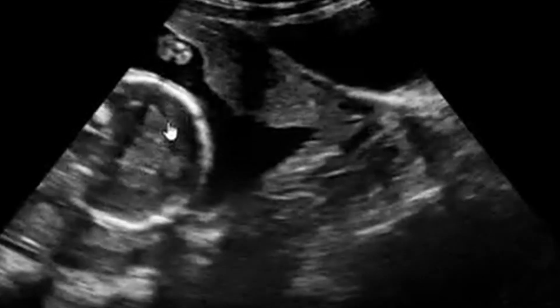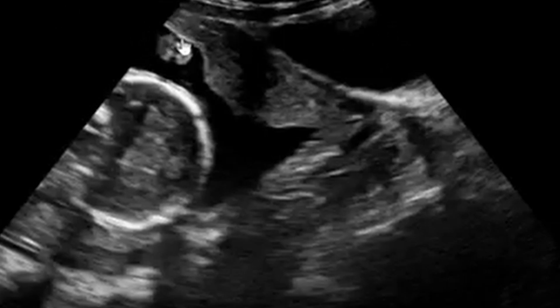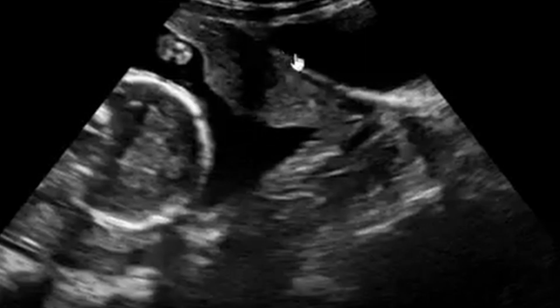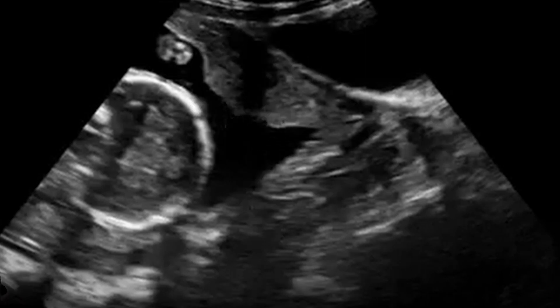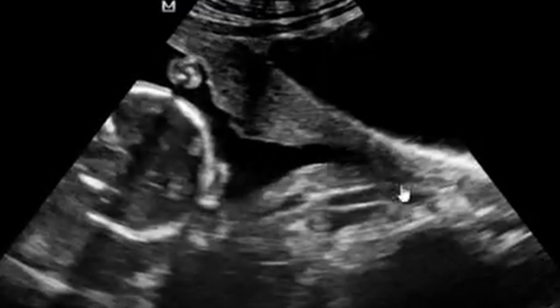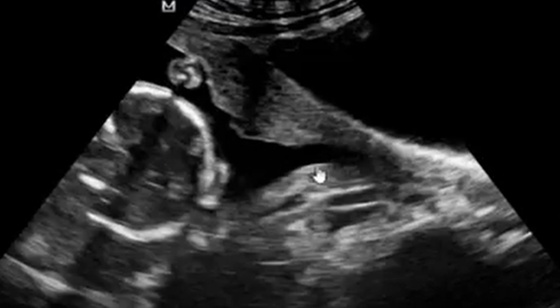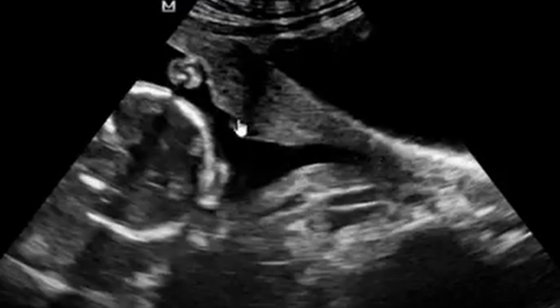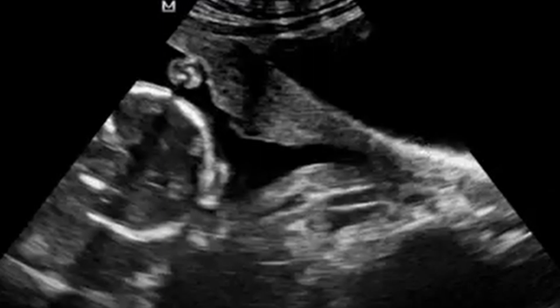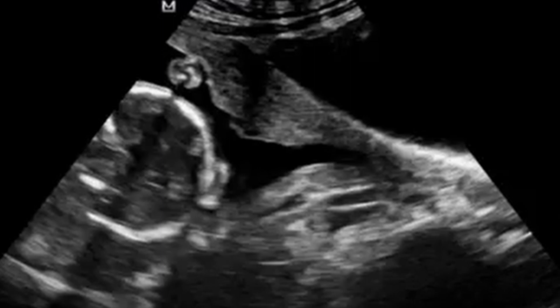This is our cervical funneling here — threatening miscarriage is imminent. You can see the funnel nicely there; this is our funnel, the fetal head is somewhere there, and we have our urinary bladder and cervical or myometrial thickening, in keeping with Braxton Hicks contractions. You can appreciate that this is an open OS, and part of the cervical canal is actually opened approximately here.